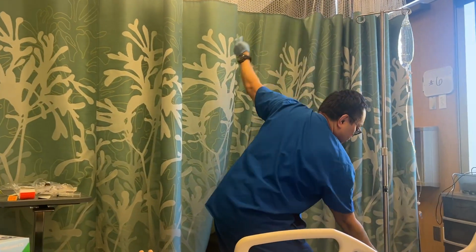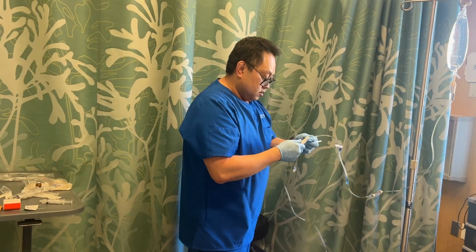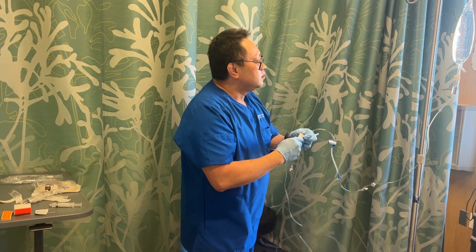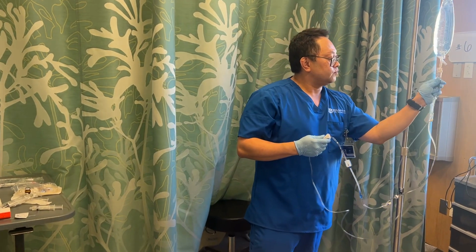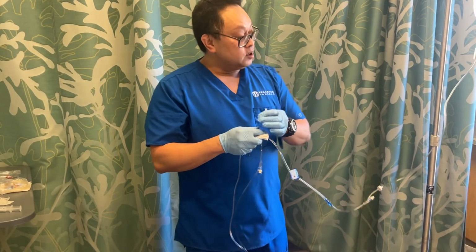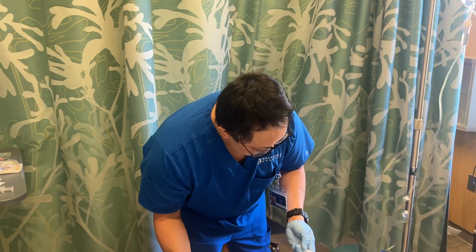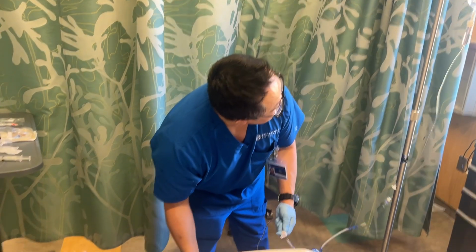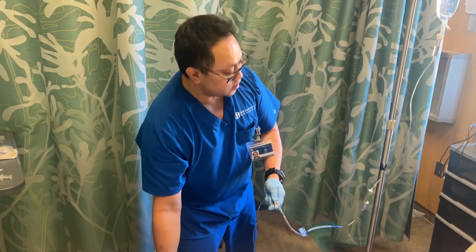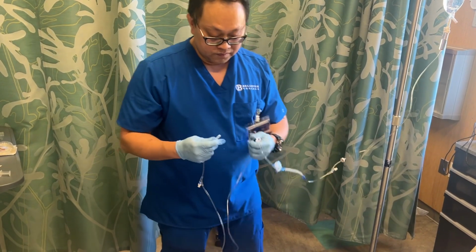I'm going to bring this all the way up, make sure it's closed. Squeeze the chamber halfway. Okay. All right, and this is still closed, and I'm going to prime it. So now I'm going to prime it. All right, you can prime it over a trash can, and it's set. Okay, so I'm going to lock it again.